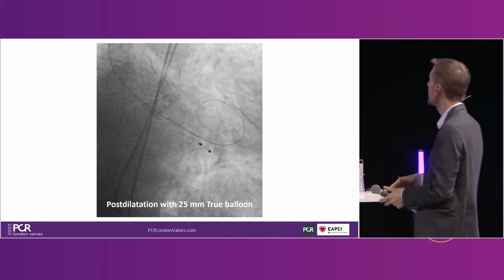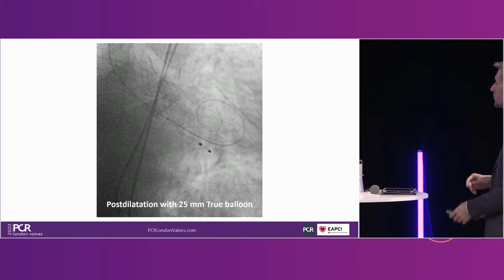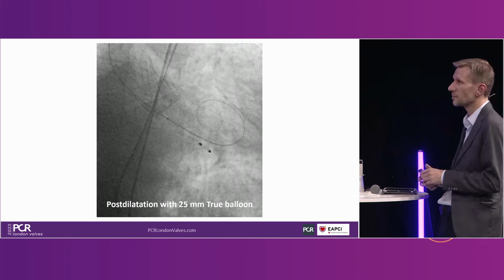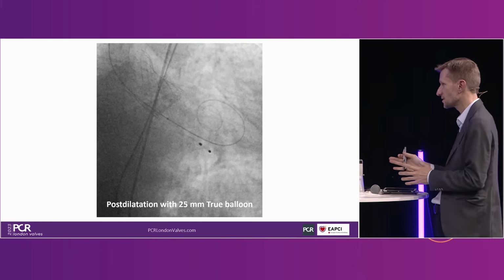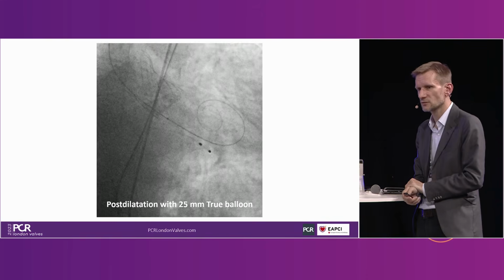And you see how high I place the balloon. It's very different from what Tobias does. But I don't like to put my balloon very deep into the LVOT. I'm always afraid that I may damage some conduction or something. So I like to keep it high.